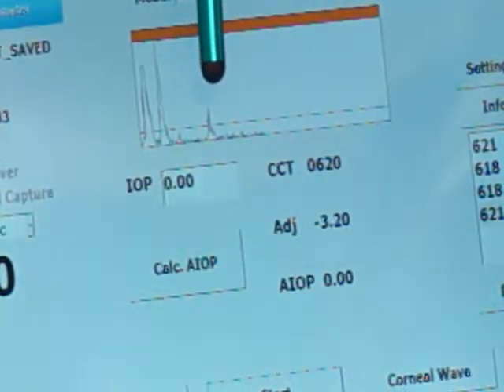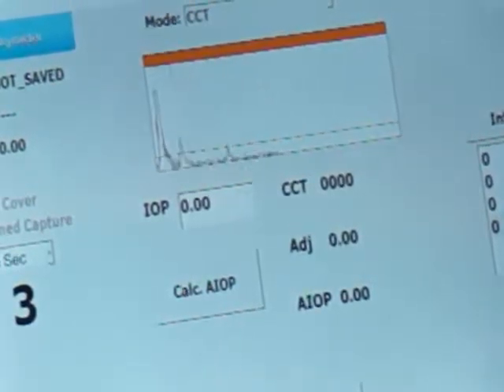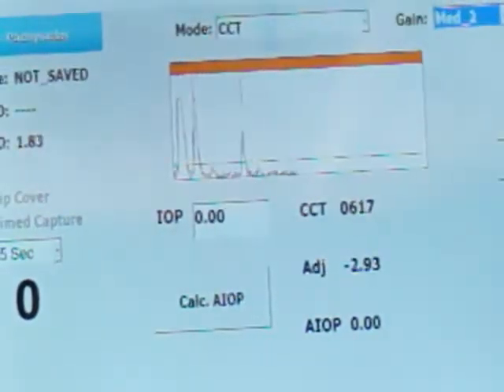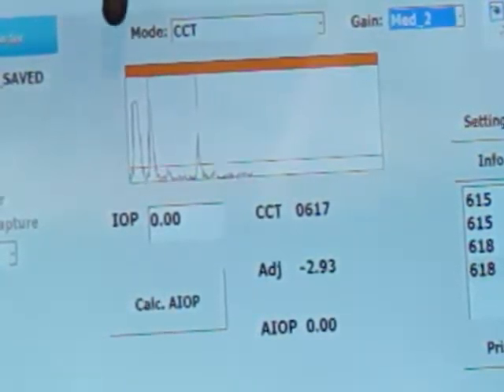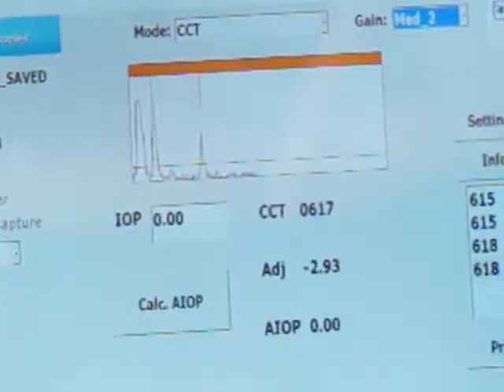Now, if your endothelial spike is too low, what you can do is you can bring up the gain of the pachymeter. So I put it on medium 2, tip cover selected, and we'll try it again. Get ready. So now I have much better gain over here, as you can see, and you get very precise numbers with a standard deviation of less than 2 micron.